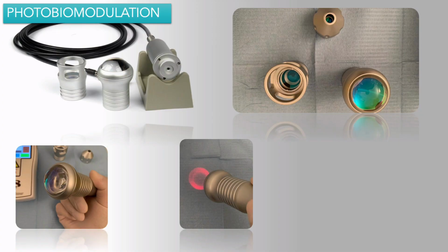The photobiomodulation is absolutely an interesting one and can be applied both in oral and perioral tissue. To be more repeatable and predictable, it is possible to use defocused handpieces specifically designed for extraoral photobiomodulation application.